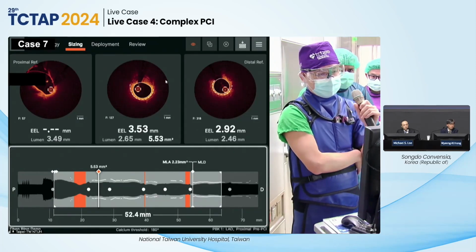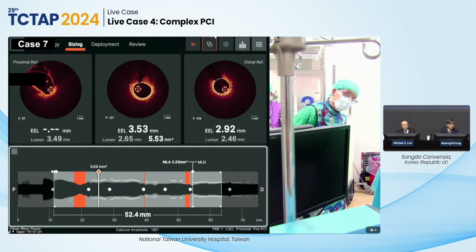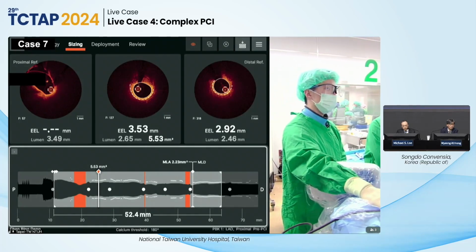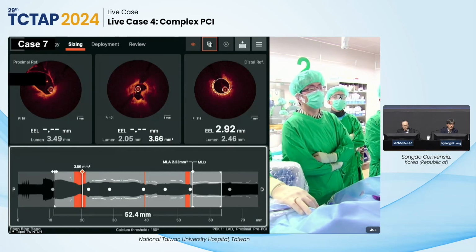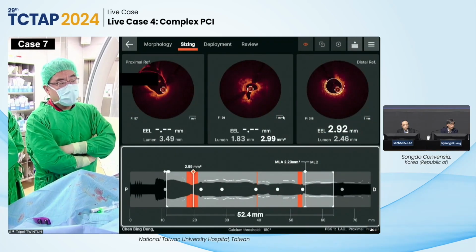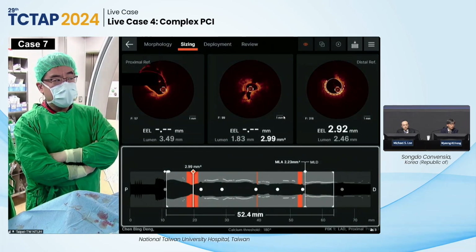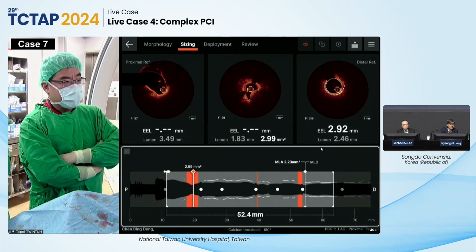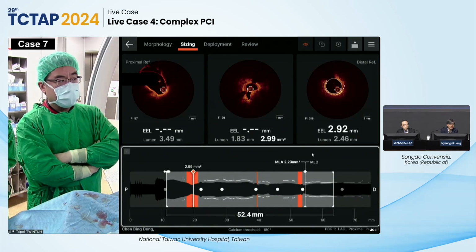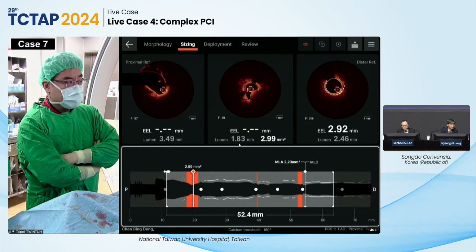So basically, this run tells us that the left main bifurcation involving the distal left main is heavily calcified with very concentric and very thick calcium. So at that spot, we probably need IVL to get rid of the calcium. But downstream LAD, even though it's diffusely narrowed, we can do just fine with balloon and stenting. The issue is the circumflex ostium. Okay, next.